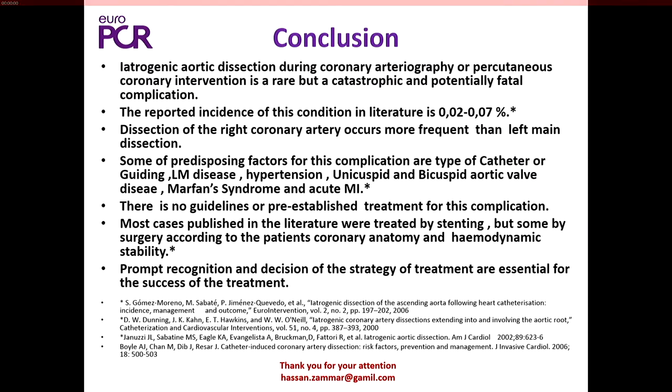The patient died, unfortunately, in maybe 10 to 15 minutes, and that was dramatic. I think I was lucky to find the left main fast. The patient started to have hypotension and chest pain, but it wasn't a long period, just 3 to 5 minutes. Also a trick was to push the guiding catheter a little bit to be sure that it's the left main and I am in the true lumen. Once I found the true lumen, I stented very fast from the ostial left main.